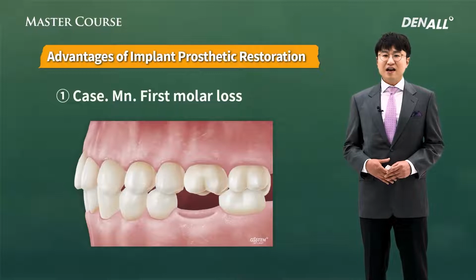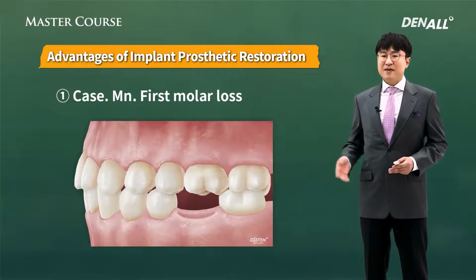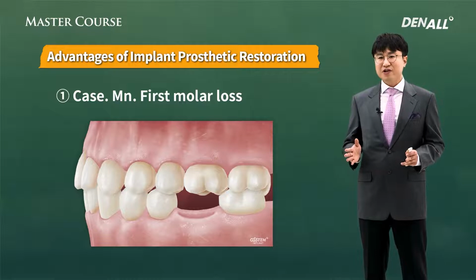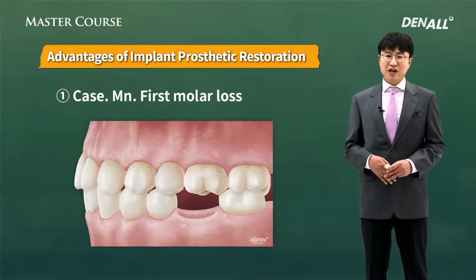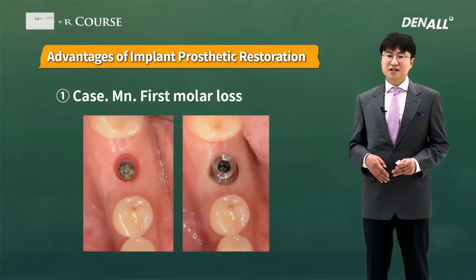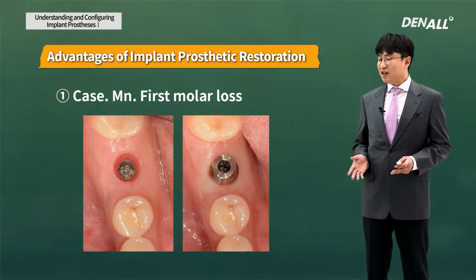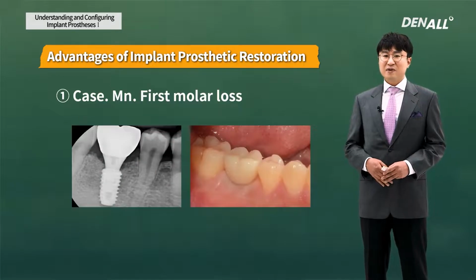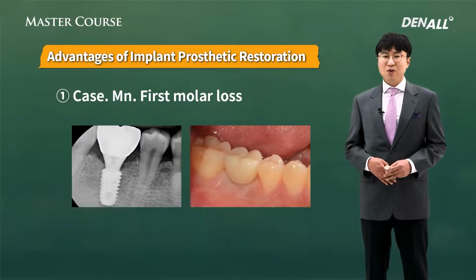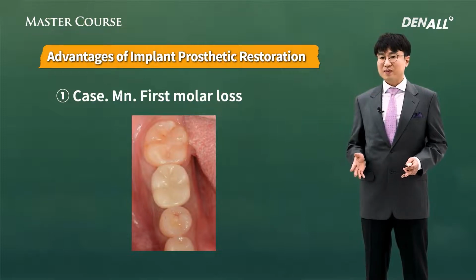If you are just studying implants, this will be the case that you will see first, like doing a case in the mandibular first molar side. It's because the bone width is sufficient and initial stability can be secured with good bone quality. So in the center, you place the implant and connect the abutment with such simple steps. You can deliver the implant, so compared to prepping adjacent teeth and delivering a bridge, it's an easier method. This is after completing the implant.